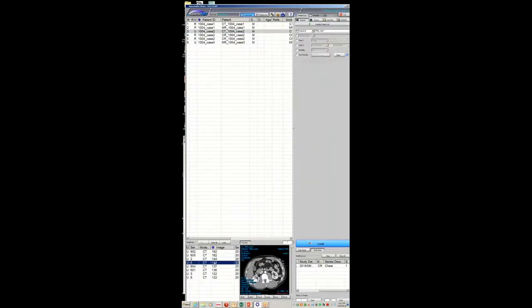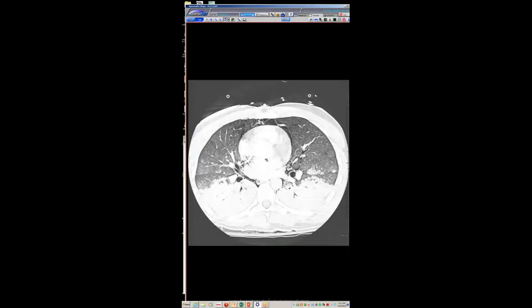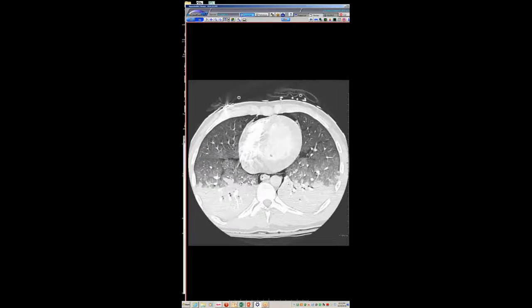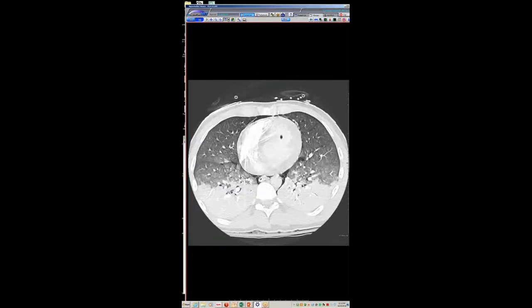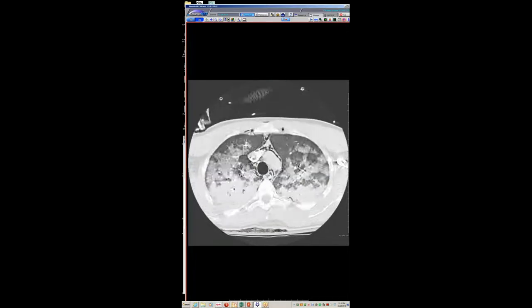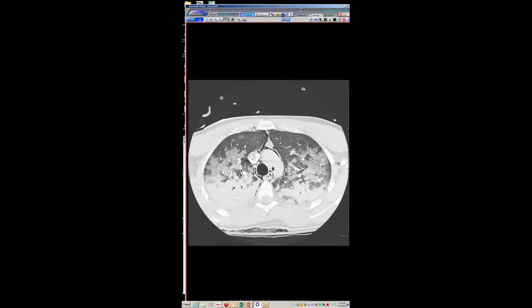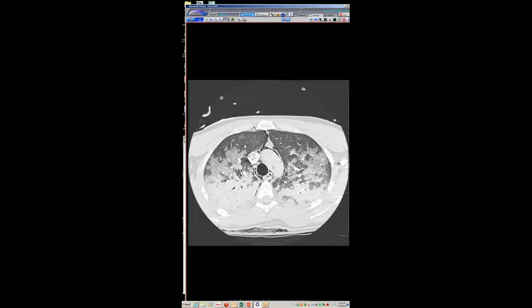We have one of the few hyperbaric oxygen chambers, and they flew him from Guam to UCSD. You can see he's got extensive pneumomediastinum and consolidation. The CT findings are interesting. We can see he's got pronounced not only pneumomediastinum but areas of pulmonary interstitial emphysema as well. He had extensive neurologic deficits on MRI, all presumed due to air embolism — Caisson's disease or whatever you want to call it.